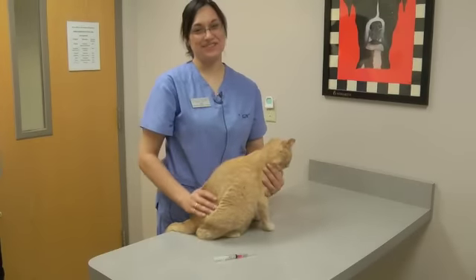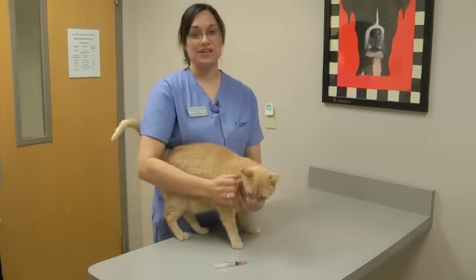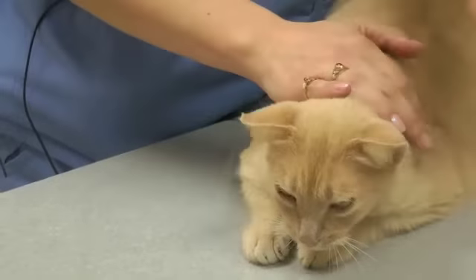Hi, I'm Jody. I'm a certified veterinary technician from Granite City Pet Hospital and I'm going to demonstrate how to give a subcutaneous injection.